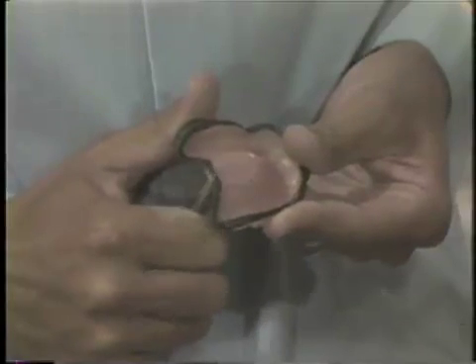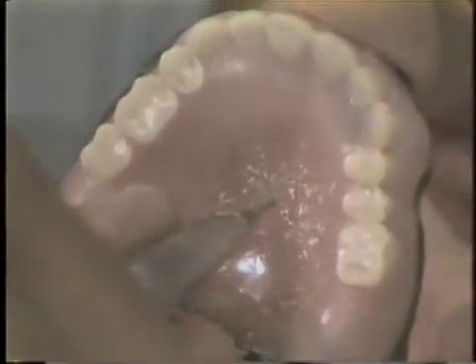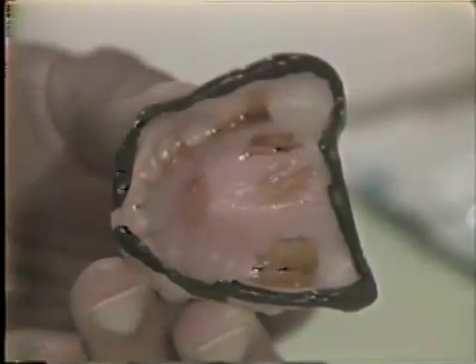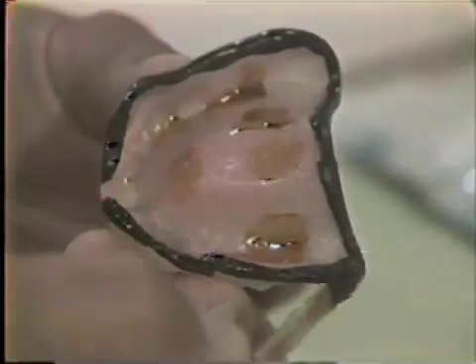The denture or border molding should be exactly where the posterior of the finished denture is to be. When the borders of the denture have been established, a hole is drilled with a number four or number eight round burr in the highest point of the vault of the denture. Because we are to use light-bodied rubber base impression material, the tissue surface of the denture is coated with rubber base adhesive. Notice that the adhesive is carried slightly over the borders of the denture onto the labial and buccal surfaces of the denture.